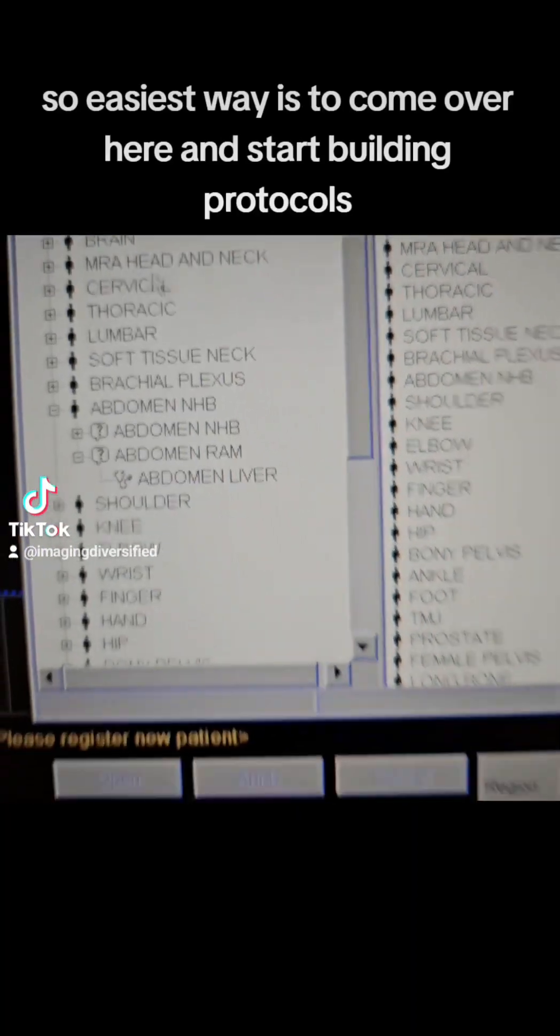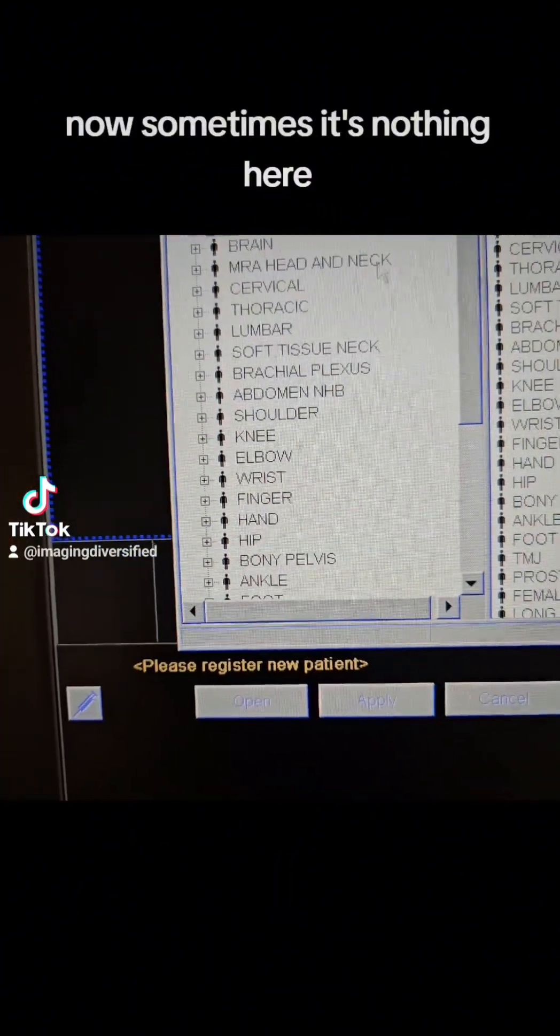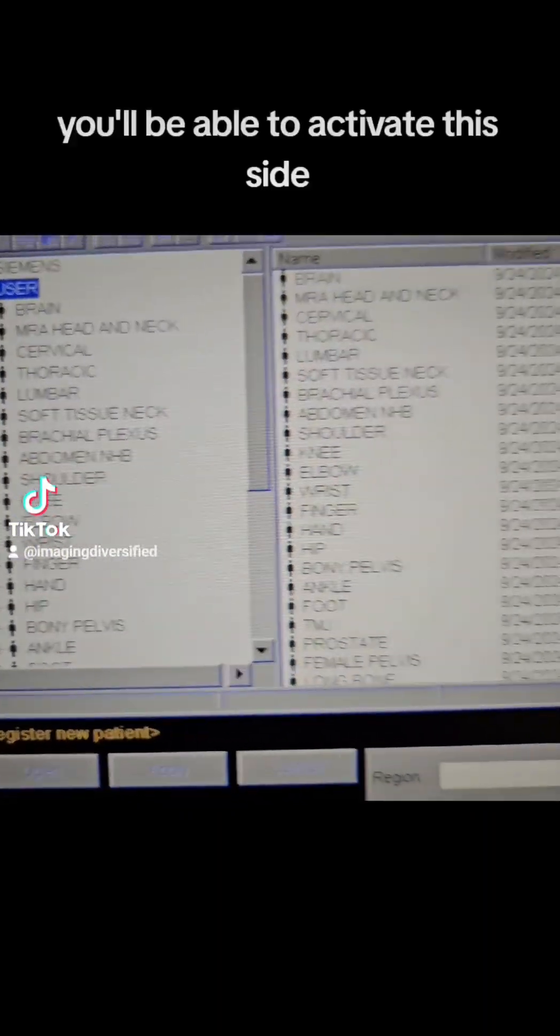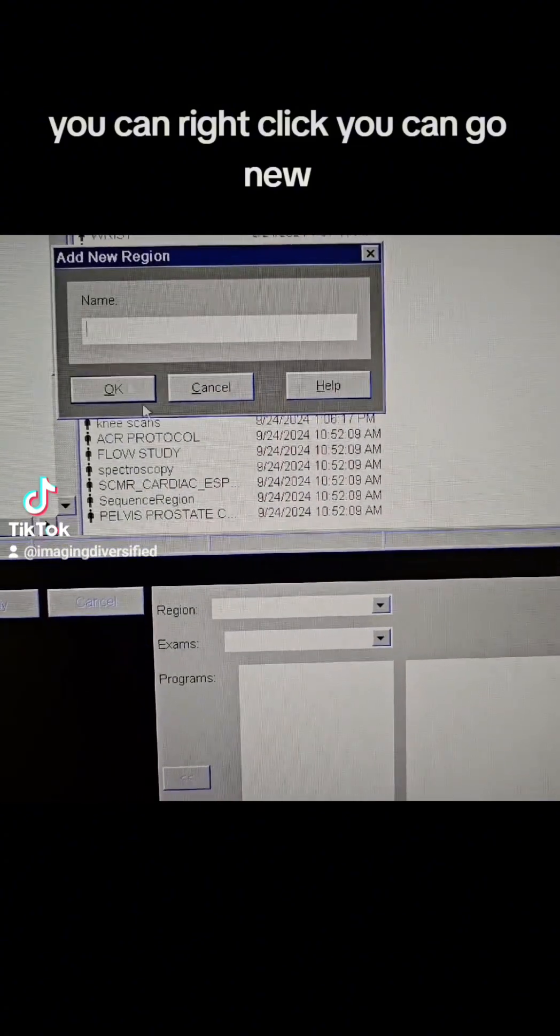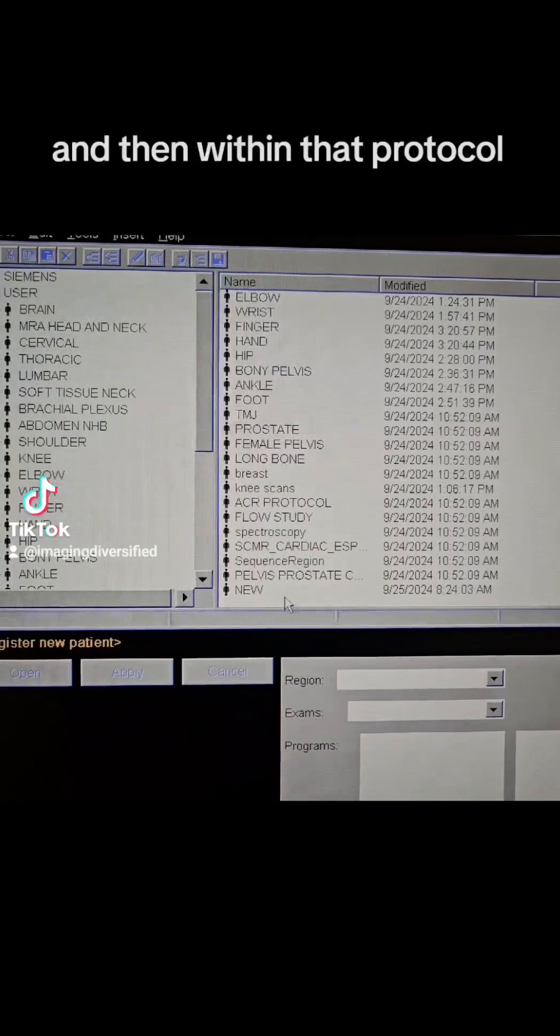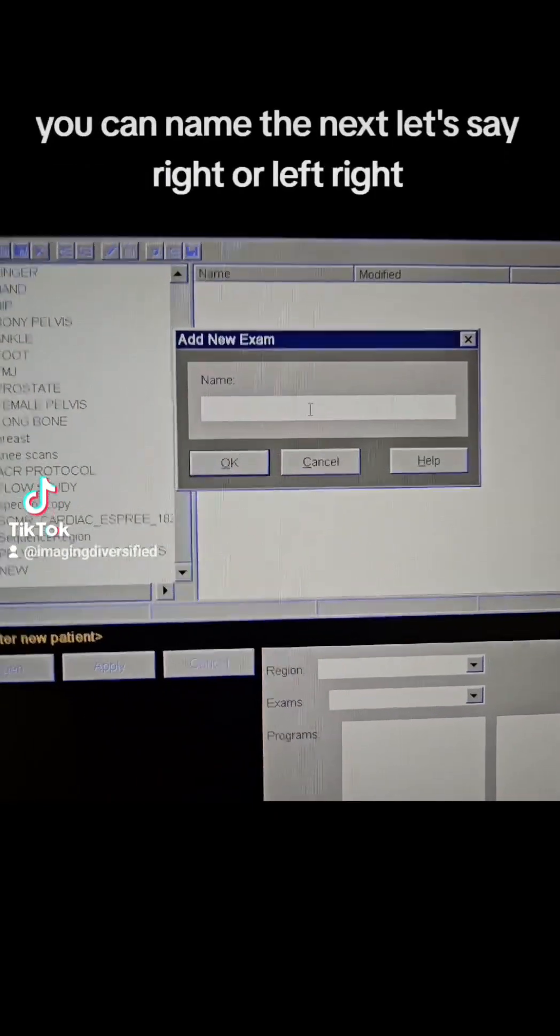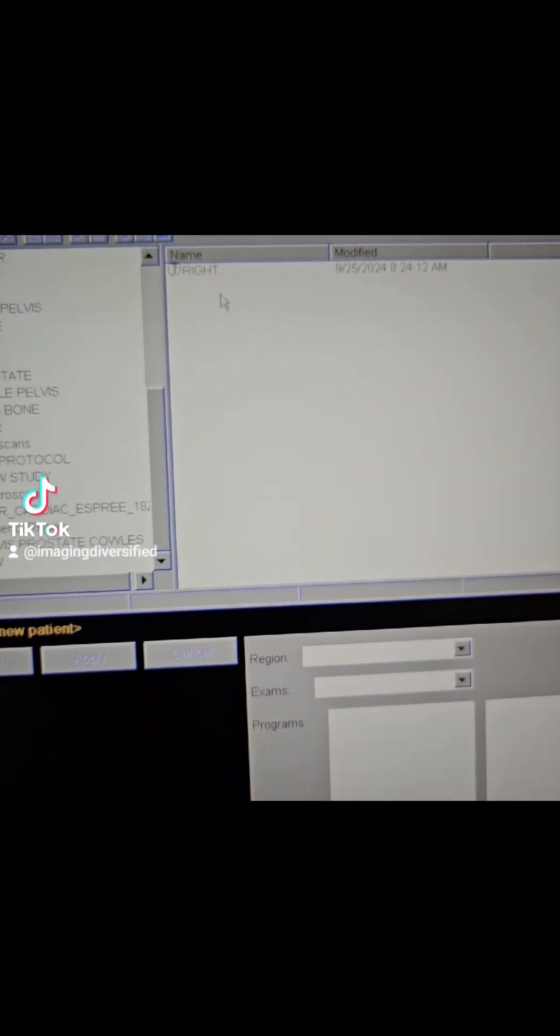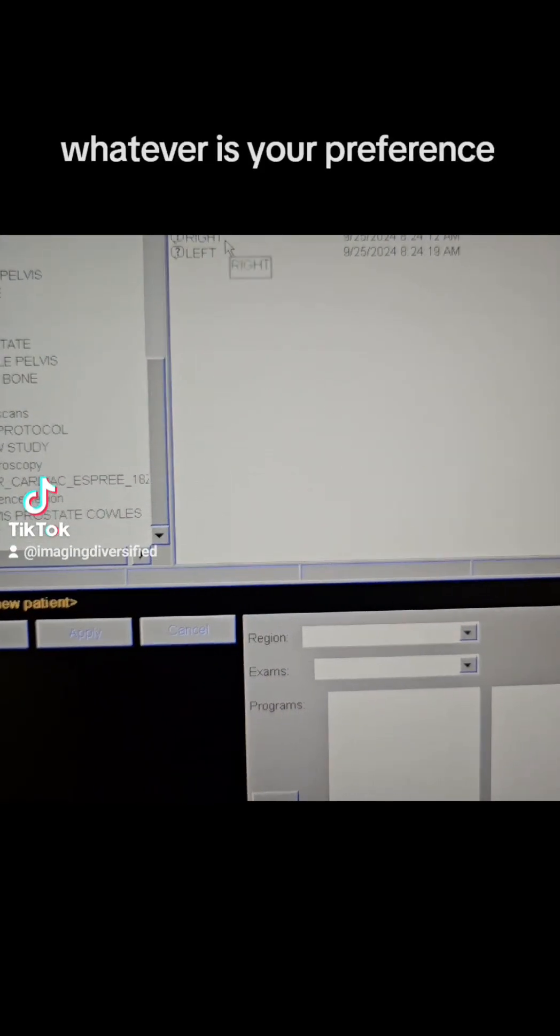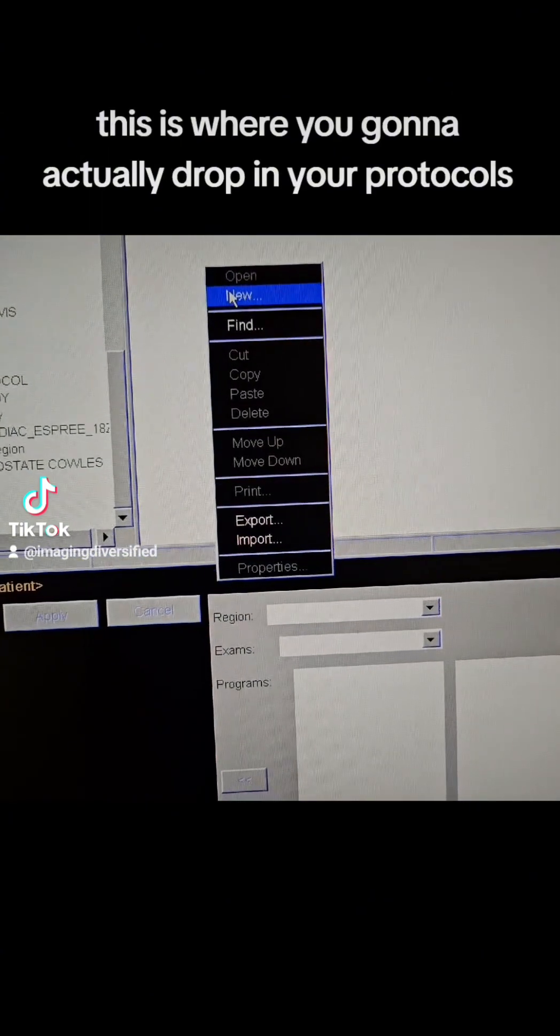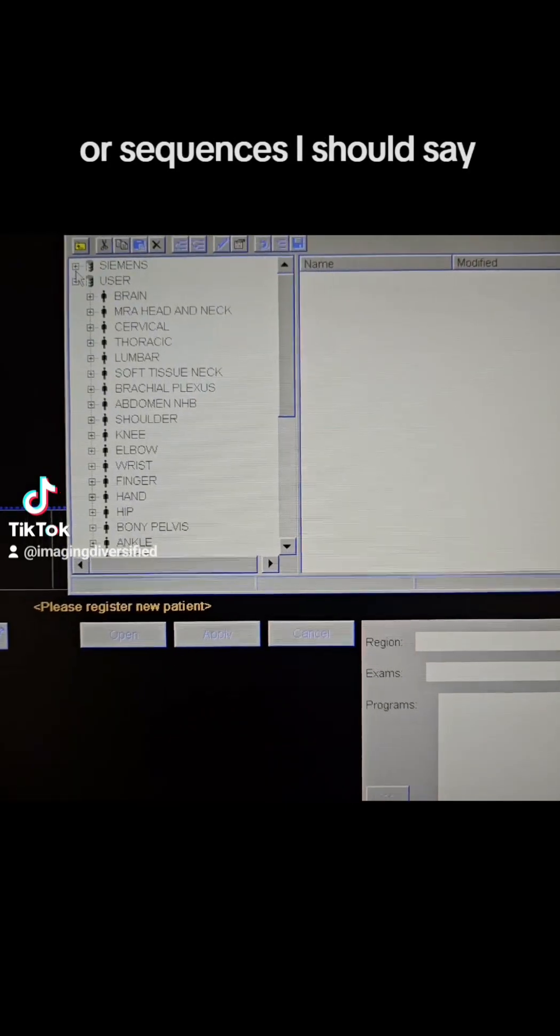So easiest way is to come over here and start building your protocols. Now, sometimes it's nothing here, and that's okay. When you click on this box, you'll be able to activate this side, and you can come down here, you can right click, you can go new, you can name a protocol, and then within that protocol, you can name the next, let's say right or left, or with or without, whatever is your preference. Then you click in here.